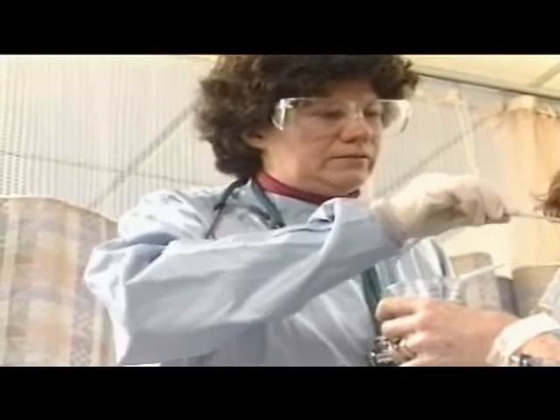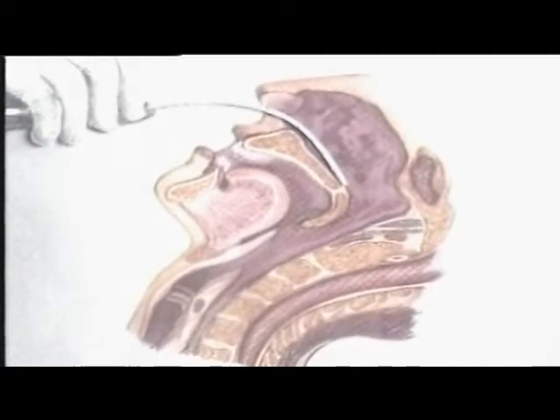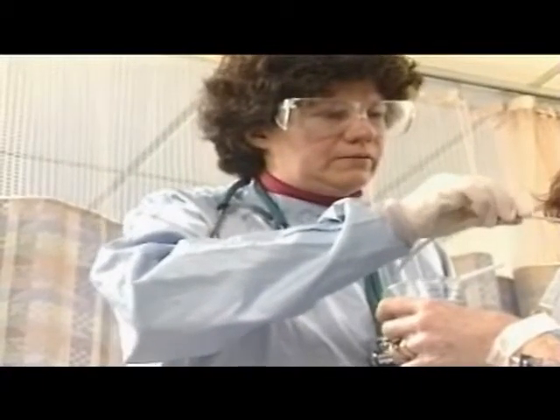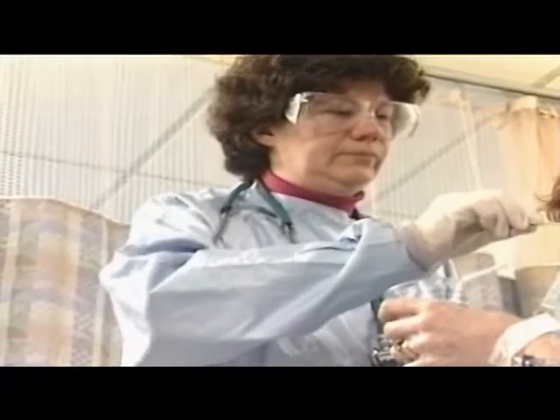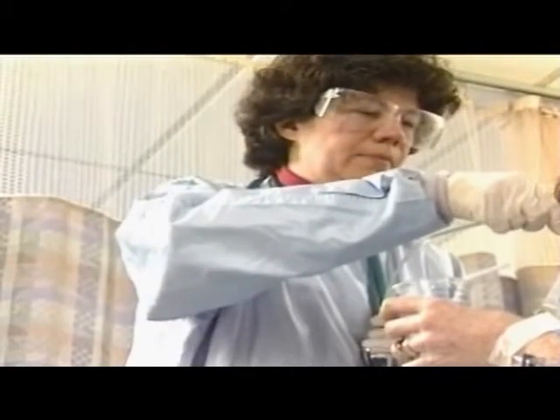Insert the tube through the nares gently and slowly, with the curved end pointing downward. When possible, the head is tilted back to aid insertion. The tube is pointed toward the ear, and the curve of the tube allows passage along the nasal floor, preventing misdirection. When resistance is felt, gently press downward and advance the tube. Do not force the tube beyond the resistance. If resistance is met, rotate the tube and try to advance again.